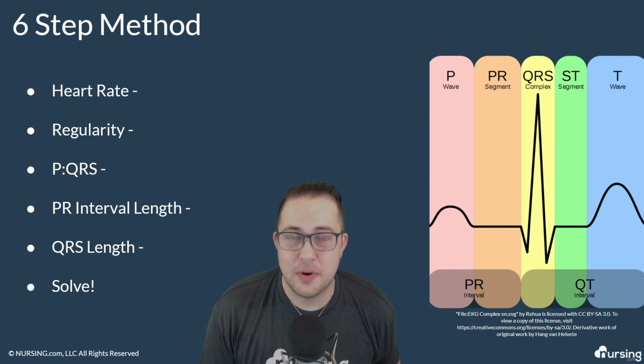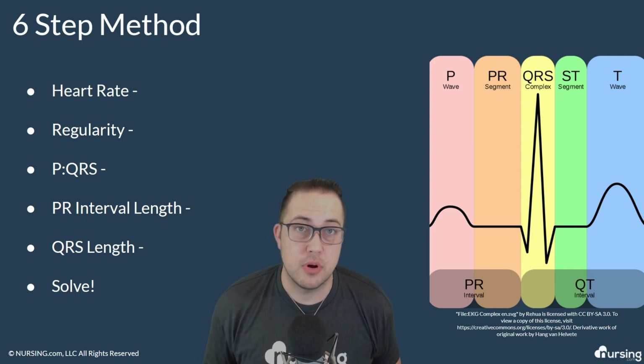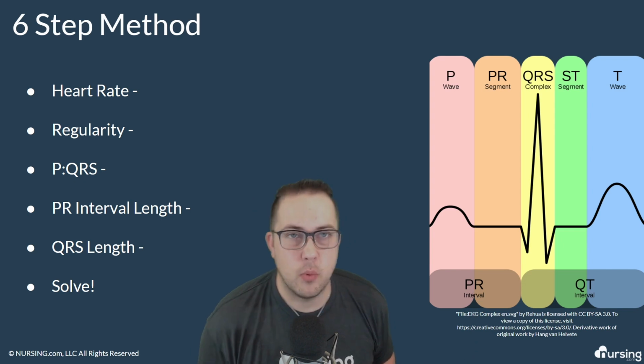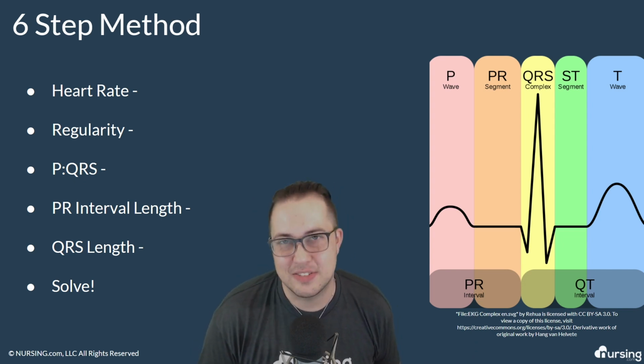Again, I highly encourage you, go check out how to solve a basic EKG strip here on nursing.com if you're not familiar with what these different types of waves are, as well as what a normal PR interval length or a normal QRS length is, for instance.